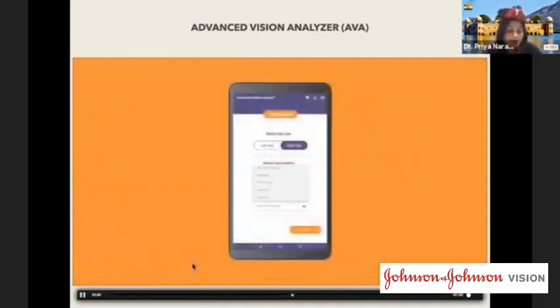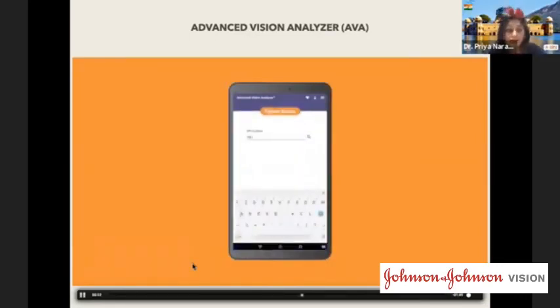The test details can be set by choosing the eye that needs to be tested, followed by the test pattern that is either a 24-2 or a 30-2 program, or a test strategy that can be either a screening, a full threshold, an ELISA test, or an ELISA fast.